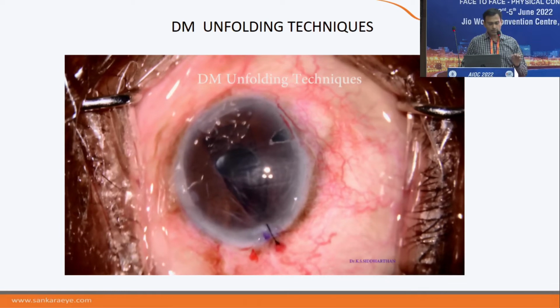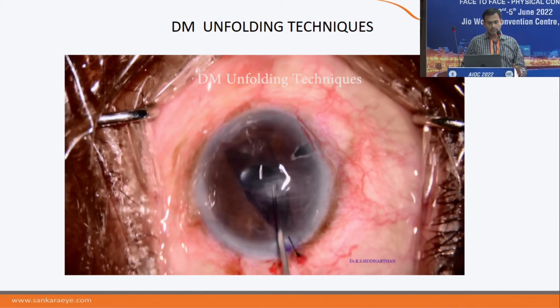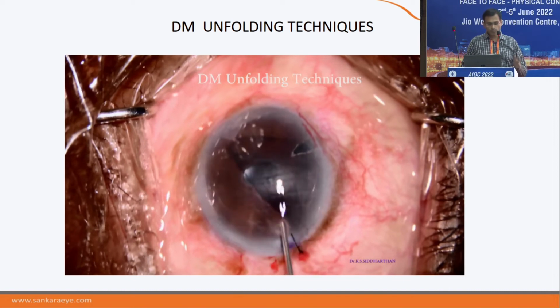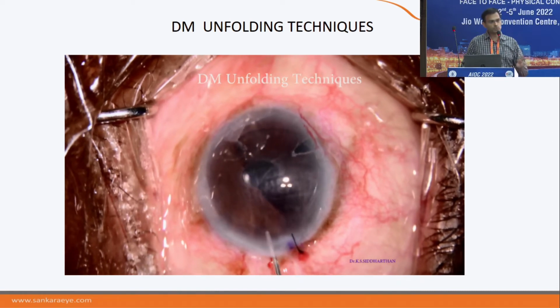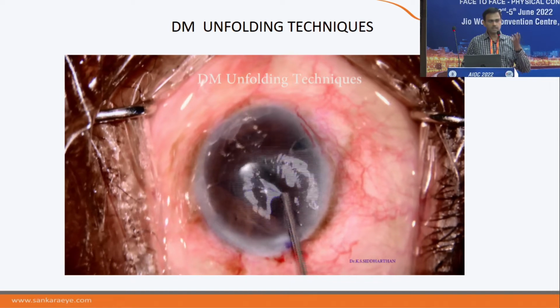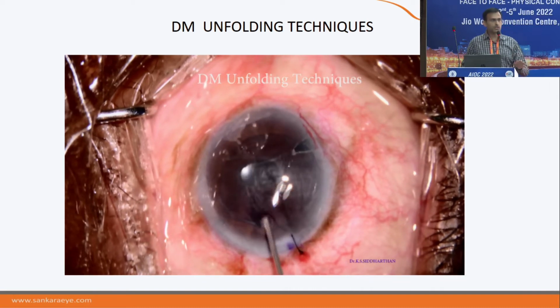You can even put a slightly tight suture because the AC can shallow. So here, before, what we used to do is inject saline and then tap the tissue like this. This was what we were doing about 4-5 years back, complete tapping. This was very destructive, because when you tap, just like grapes, how it used to be sticking to the DM, the cells will just fall and you'll get a lot of damage. So this was what we were doing initially.